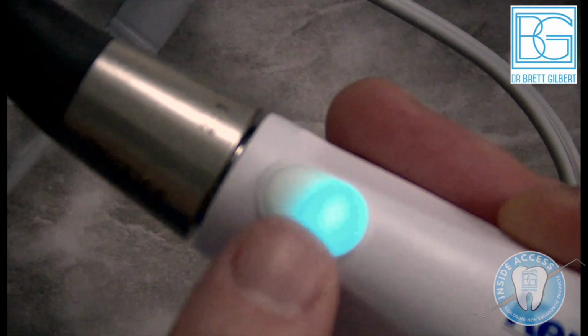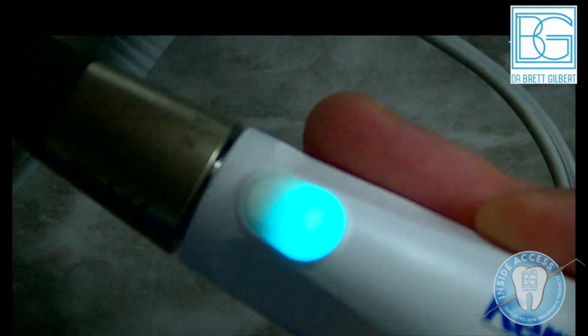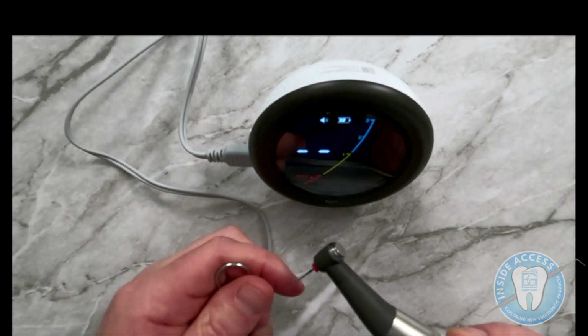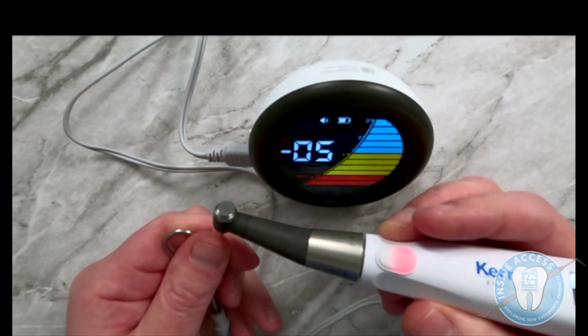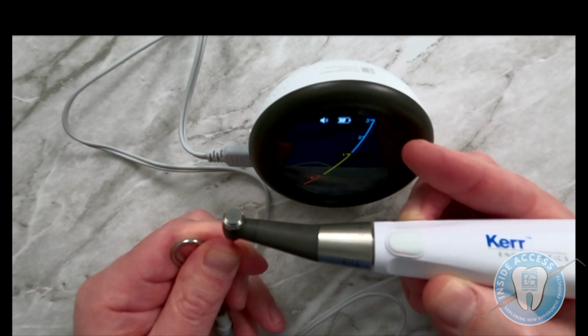So you're going to be able to monitor where you are in the same way that you'll be able to monitor on the apex locator. So let's take a look at this in action. Again, when I bring this in, what you're going to see immediately is the light up on the rheostat button as well as here on the probe.